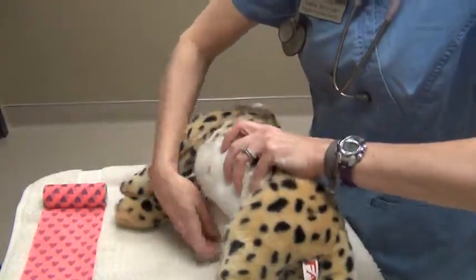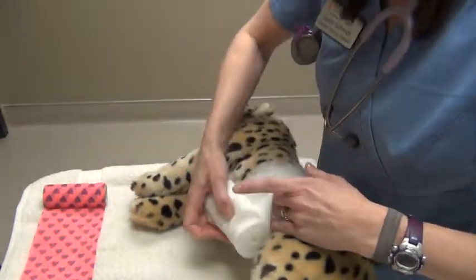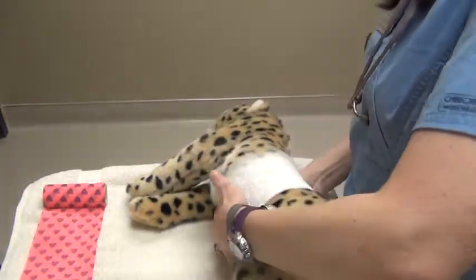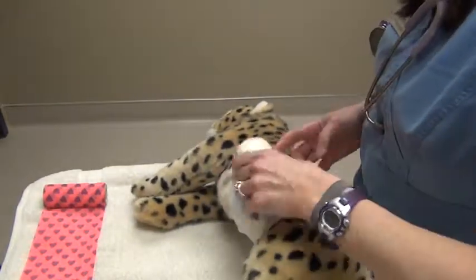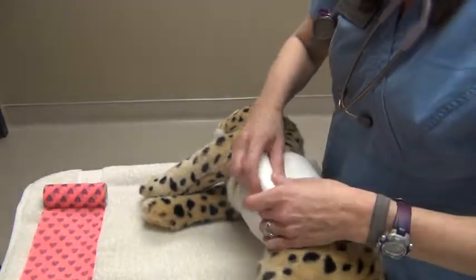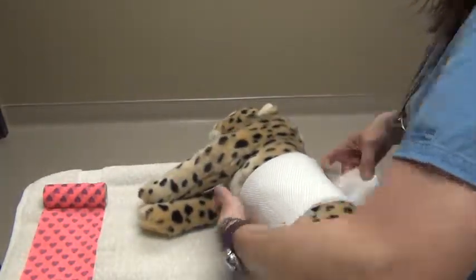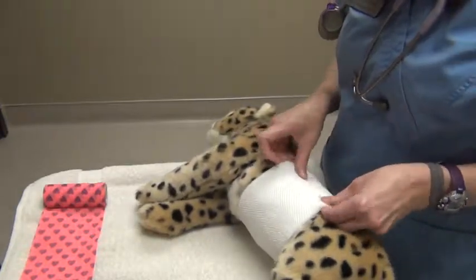Then we go ahead and start rolling my cast padding around to keep that in place. So I'm going to make a couple of layers. I'm going to keep it nice and light. You don't want it to be tight unless you're doing a compression wrap. And we're not doing that. We're just doing a simple abdominal bandage. So we've got our secondary layer on.